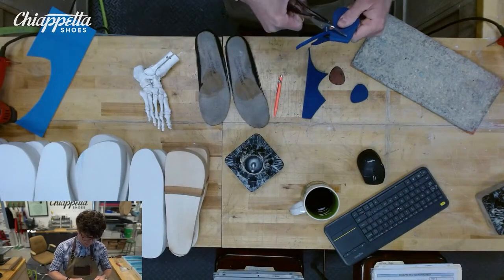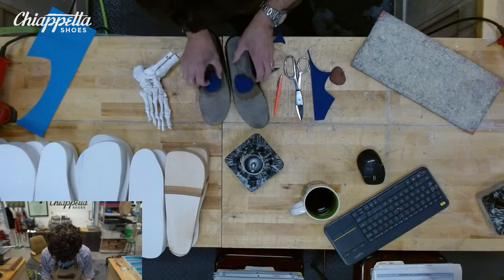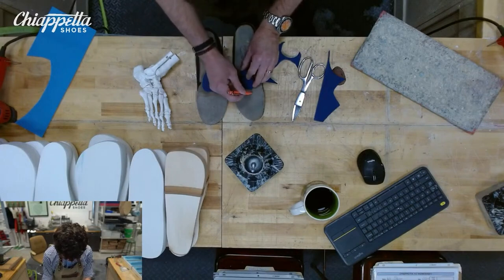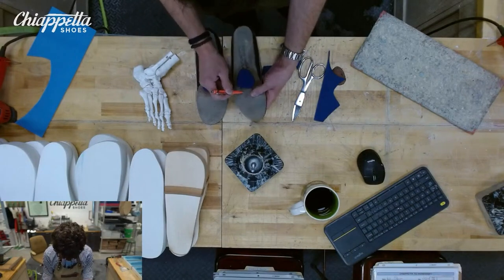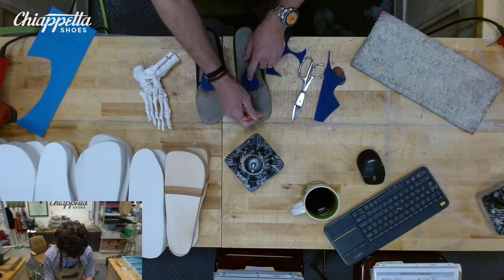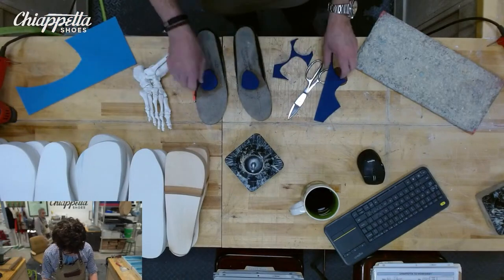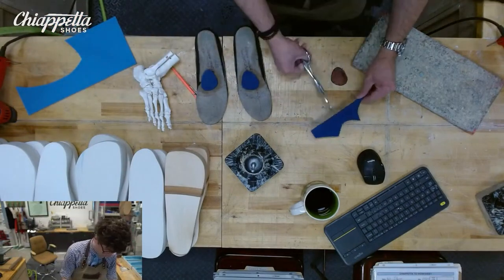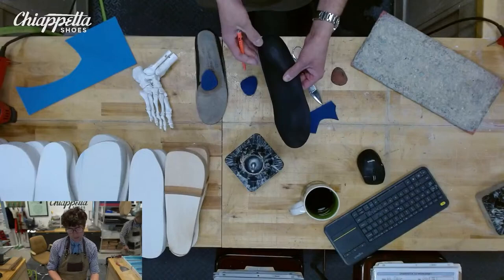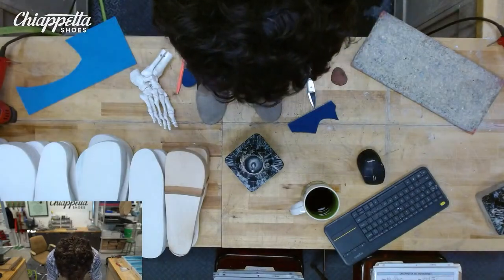So on this change, again, I'm getting a little bit more focused and dialed in. Now, we're going to hit more closer, up a little bit more. Second met, we got right here. Third, fourth, fifth, first. All right, boom. We're going to get a little bit farther forward, just a hair. Try to help offload that second hammer toe. The other thing that we're going to do, because this is a B7, should be a high arch, but there's a lot of mobility in the rear foot. I'm not going to do any medial wedging. That would be overkill. If we're trying to over support the heel and ankle, it's not about that. It's more about just that medial arch. So we're going to do a standard medial scaphoid pad.